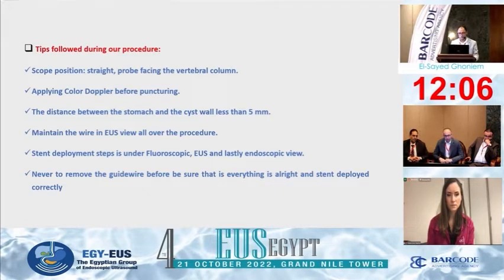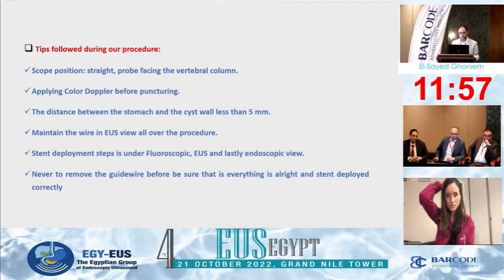During stent deployment, we should take our time under fluoroscopy, under EUS, and also maybe under endoscopic view. Also, the last thing is never to remove the guide wire except when you are satisfied that everything is okay and the stent is deployed inside.